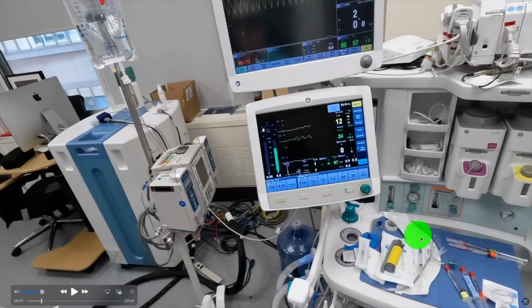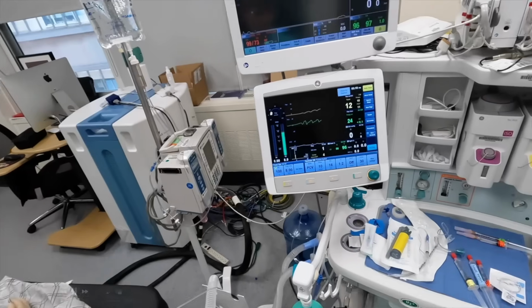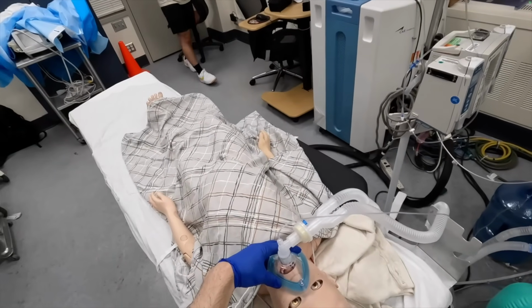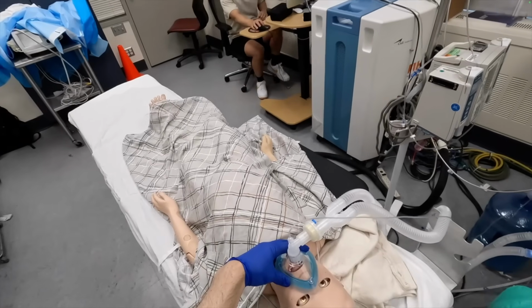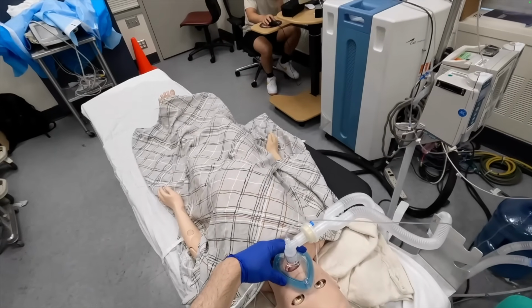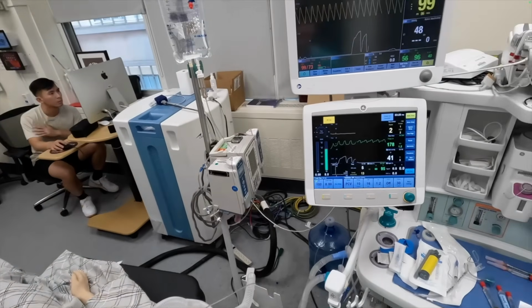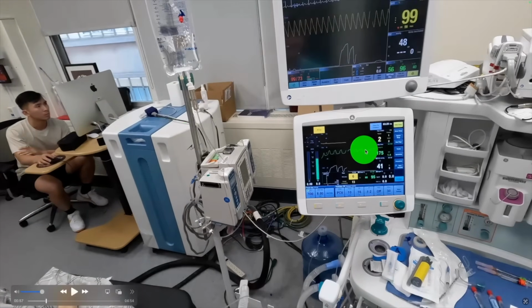And I'm also taking a look to make sure I've got all of my airway equipment, my IV equipment, and emergency medications, as well as the regular medications that I intend to use. And imagine what it's like walking onto the rocket ship right now, taking nice deep breaths of oxygen as we're on the launch pad, just thinking about what it's gonna be like once we get up to outer space. You can see that the tidal volumes have come up to 175, so that's a pretty good amount for a patient who's 5 or 6 years old and weighs 20 kilograms.